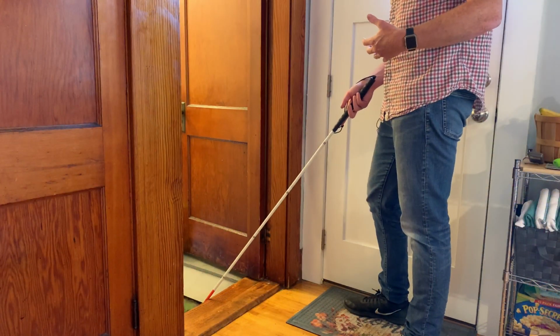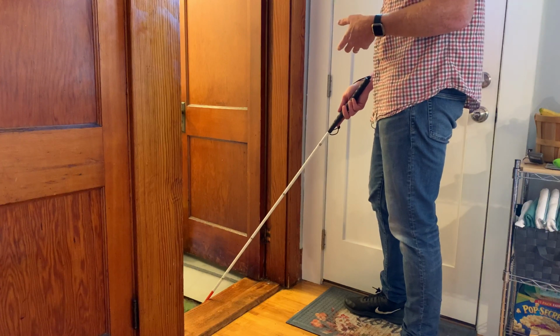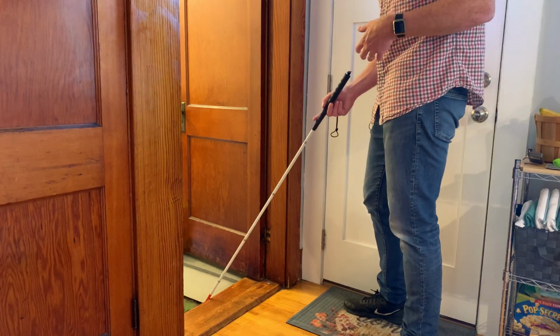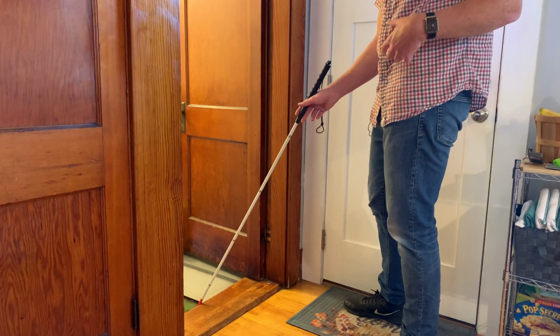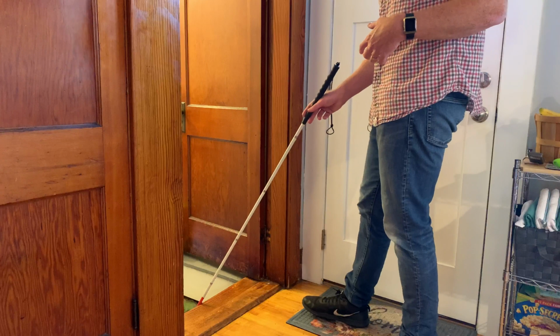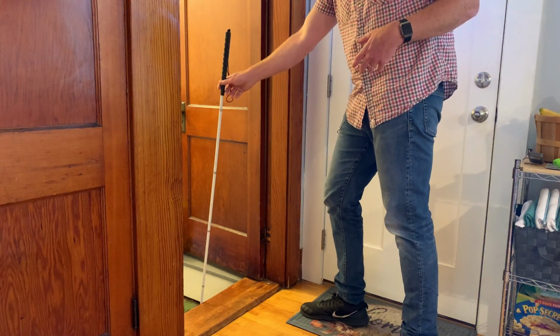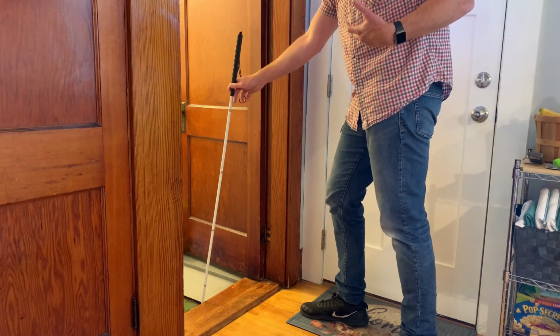For step two, after your cane tip drops over the edge of the landing towards that first step, you're going to want to bring your cane up vertical. To do that, you'll switch over to pencil grip. When I'm bringing the cane up vertical, straight up and down on that first step, I want to be using pencil grip. It just makes it easier to hold and get into that position.